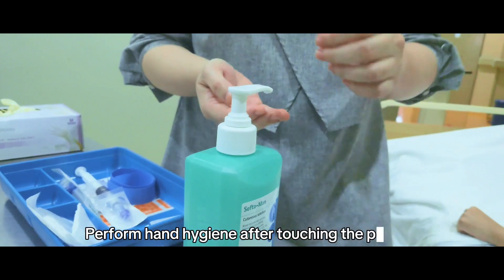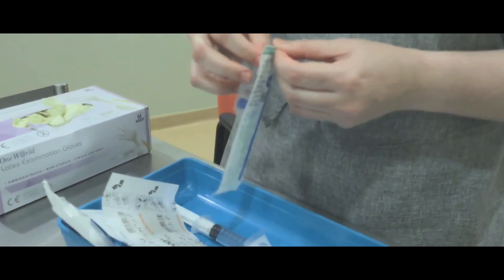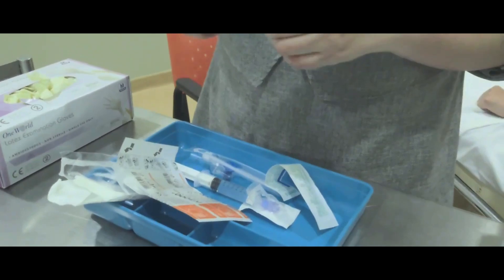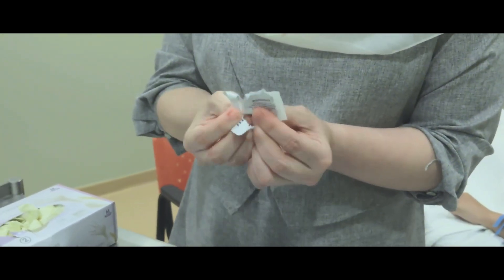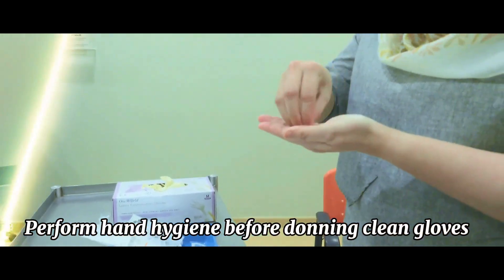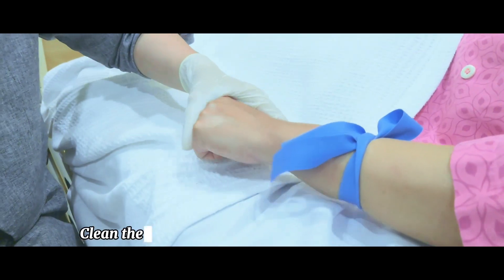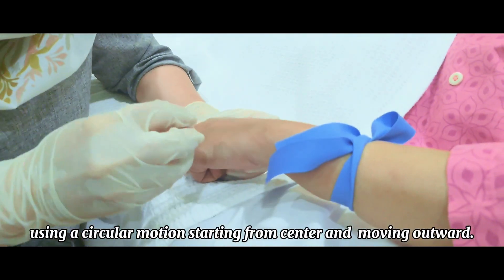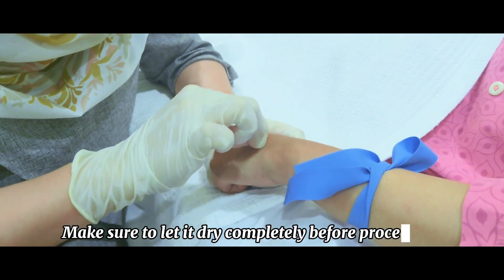Perform hand hygiene after touching the patient, then perform hand hygiene again before donning clean gloves. Clean the insertion site with 70% alcohol swabs using a circular motion, starting from the center and moving outward. Make sure to let it dry completely before proceeding.